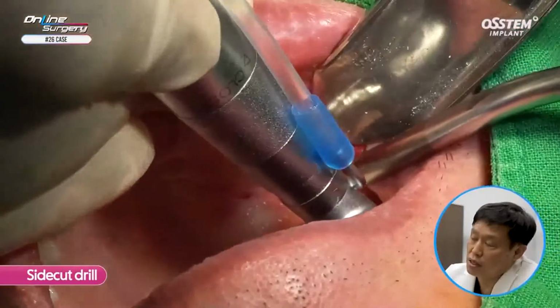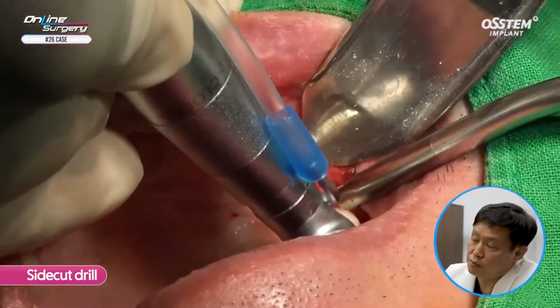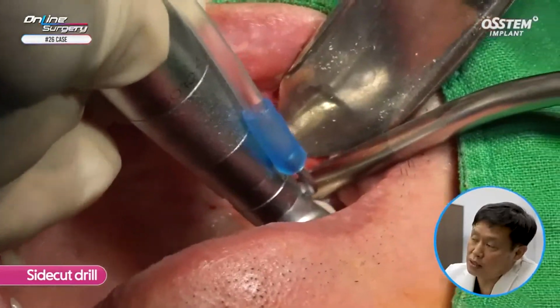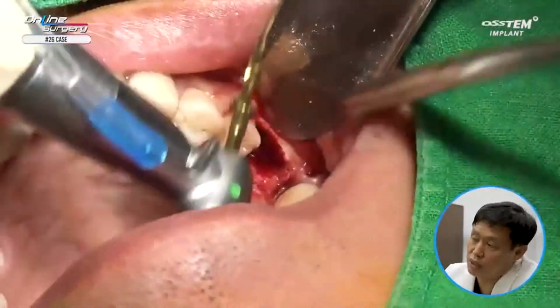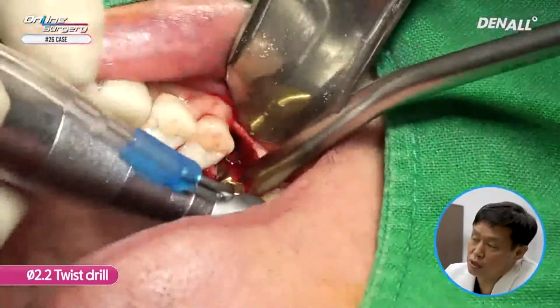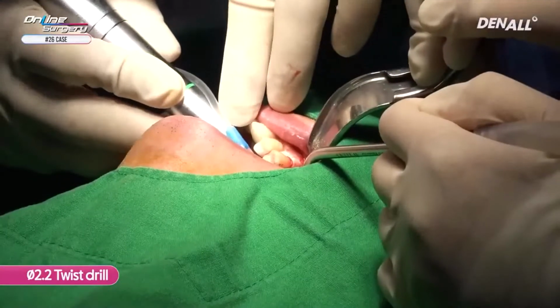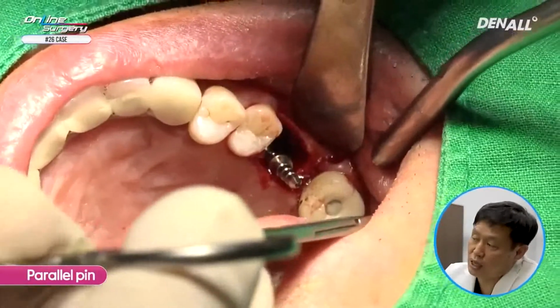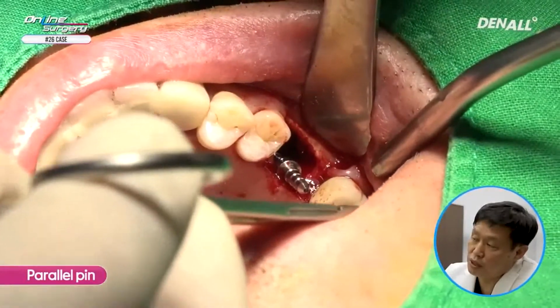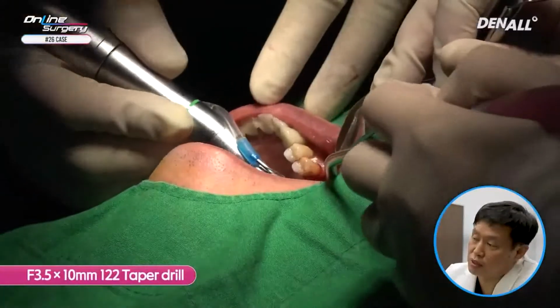A side cutting drill was used to prep the site for implant placement. I'm going to place it slightly more palatally compared to the existing site. A 2.2 twist drill is going to be used to make the drill hole. Because it can slip, you need to pay attention. A parallel pin is going to be placed. You can see that it has been placed at a similar level with the distal tooth number 27.